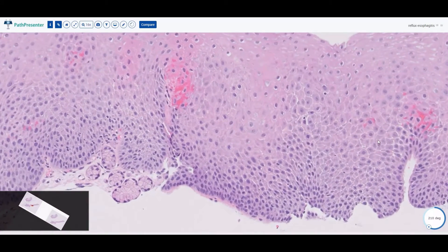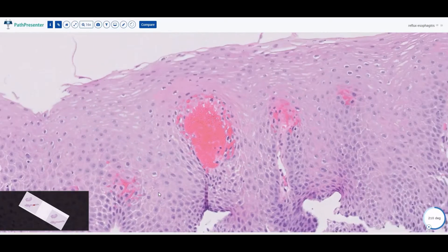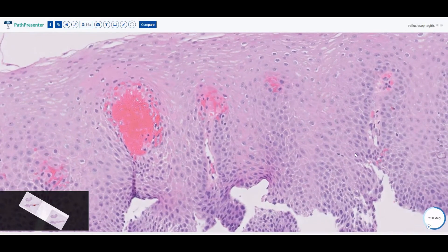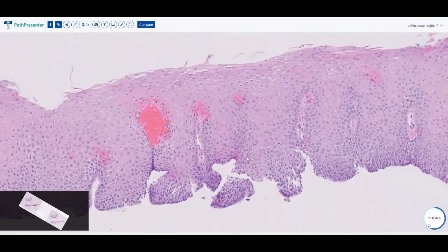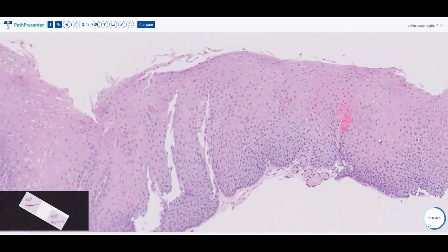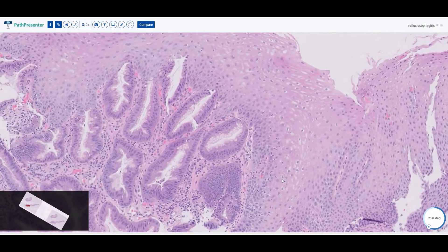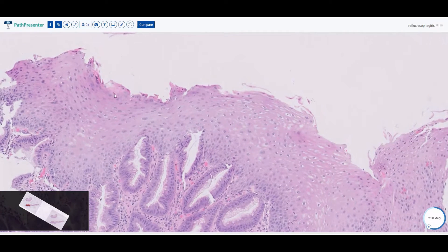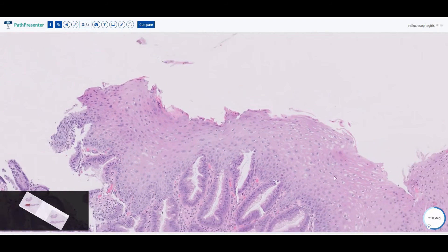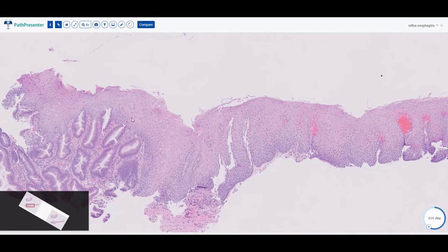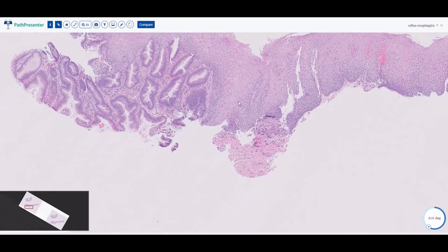Other findings could be eosinophils instead of neutrophils, or a combination of both. For example, right here you have an intraepithelial eosinophil, and over here you have an abundance of intraepithelial neutrophils. All taken together you could call this active esophagitis consistent with reflux changes, but usually we'll just call it reflux esophagitis if all the features are there.